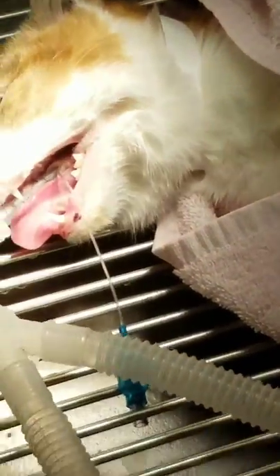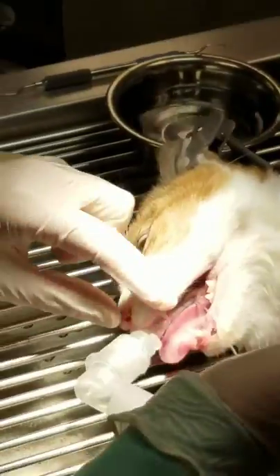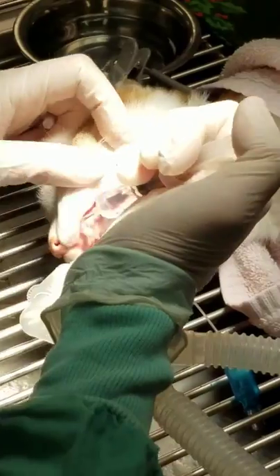Okay, alright, I'm going to pause. And if you want to get a shot of that diluted chlorhex. Alright. Chlorhex. Your professor is going to get so sick watching this video, by the way.